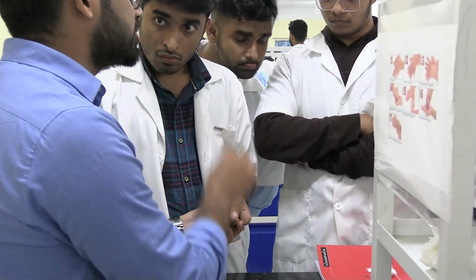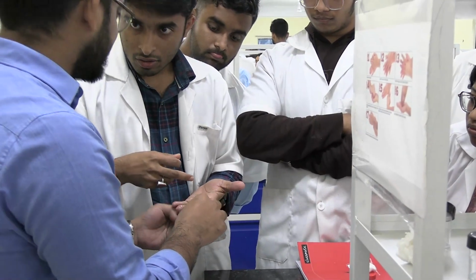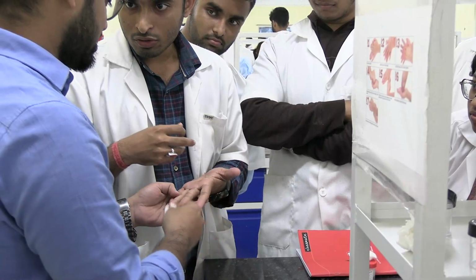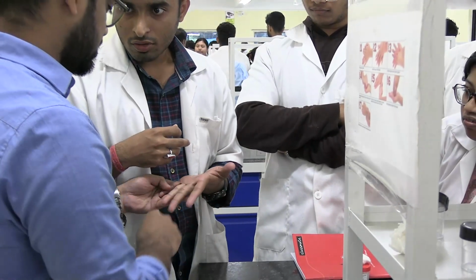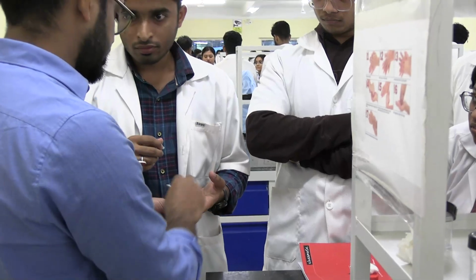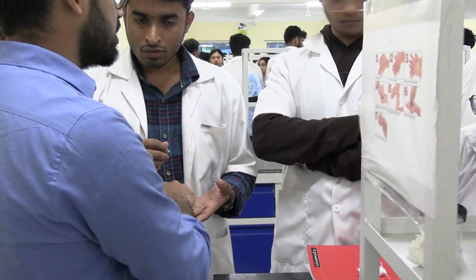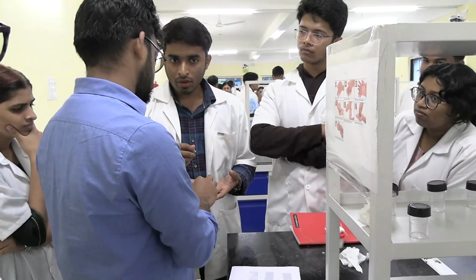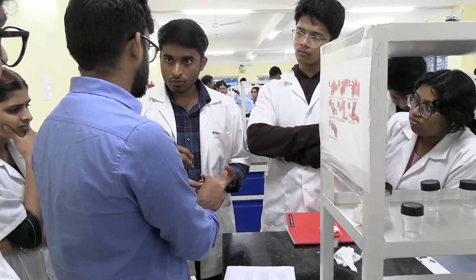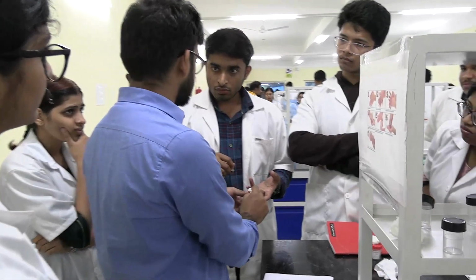Before pricking, make sure the spirit is dry. His hand was not dry. That's sweat. Why are you sweating so much? Only palmar, ventral. Does it affect your sensation of temperature?